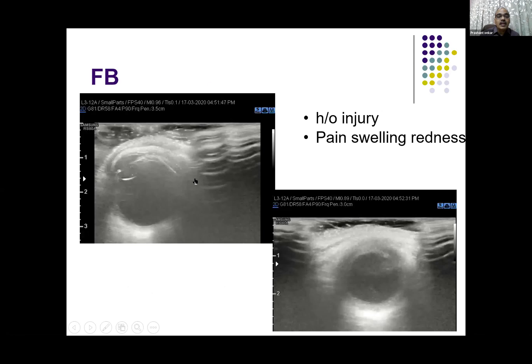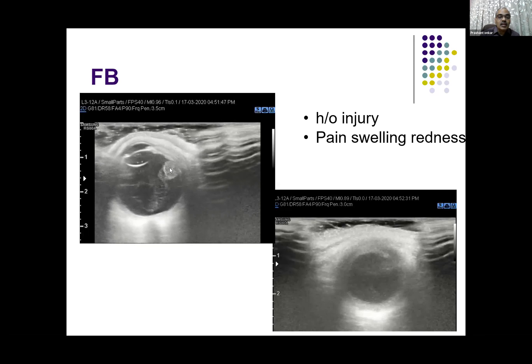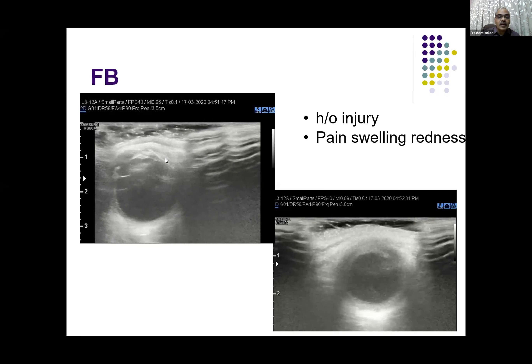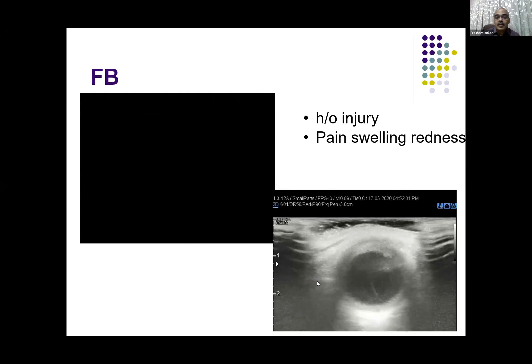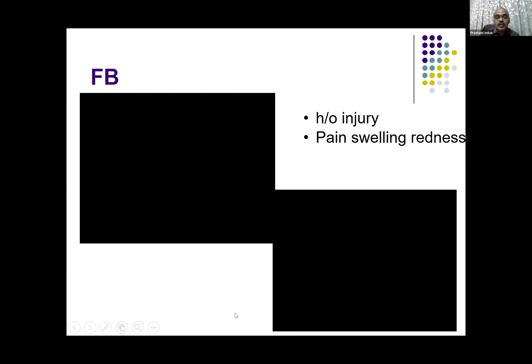This is an example of a patient who had an injury with pain, swelling, and redness. The anterior chamber is normal, the lens is also normal. But there is a linear echogenic foreign body embedded in the sclera — it has entered the vitreous, and there is collection at the distal end of the foreign body. You can see numerous internal echoes indicative of vitreous hemorrhage produced by this injury.